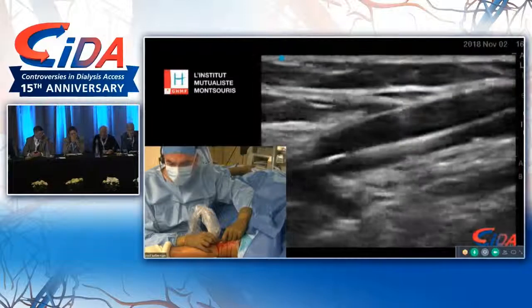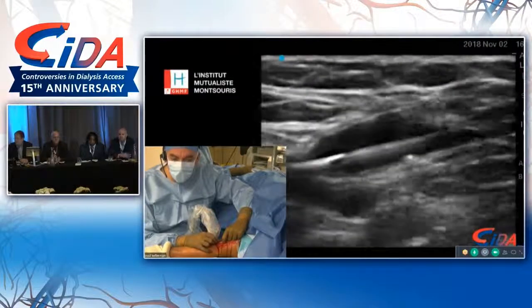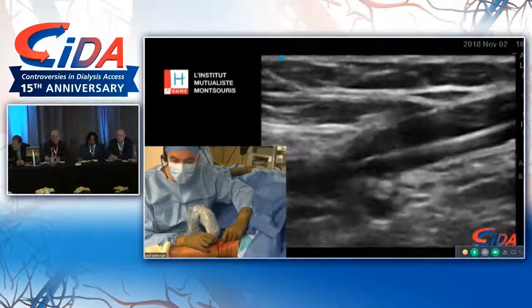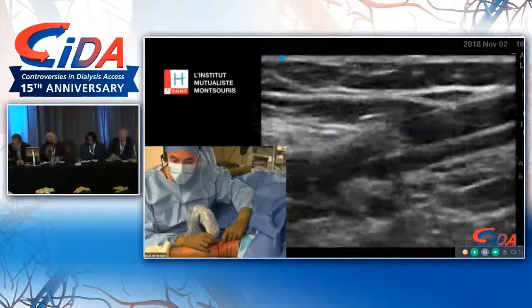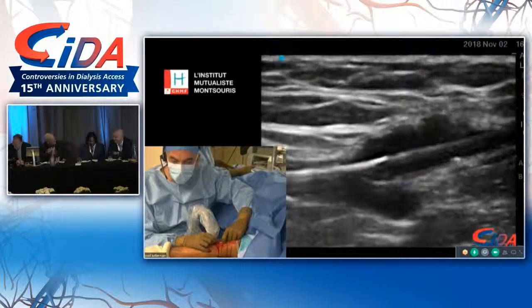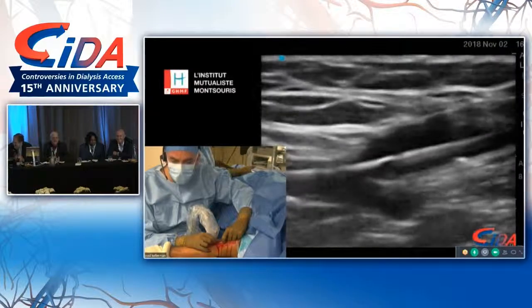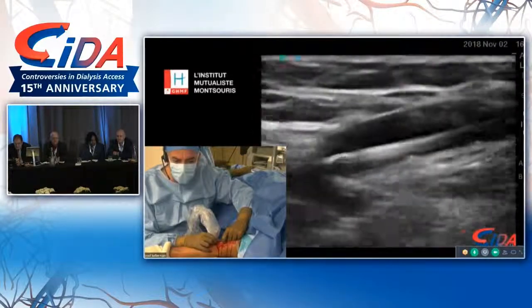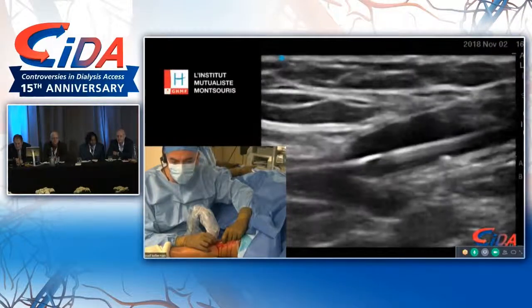Do you give any antispasmodics before or during the procedure? Is this Ingmar? Yes, I'm here. Hi, Ingmar. Thank you for the question. So I do not. I know that my colleagues, Dr. Hall in particular, gives a cocktail, but I do not. I don't have this habit, even when I do my open cases. So this is why if I have spasm, I will just give it some heparin to give it some time to recover.